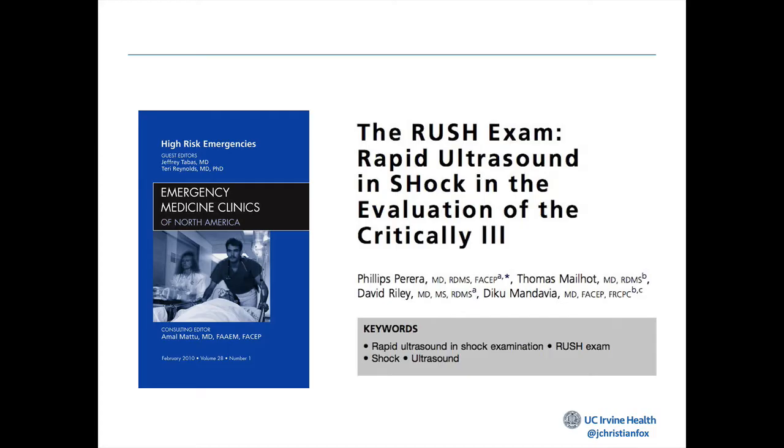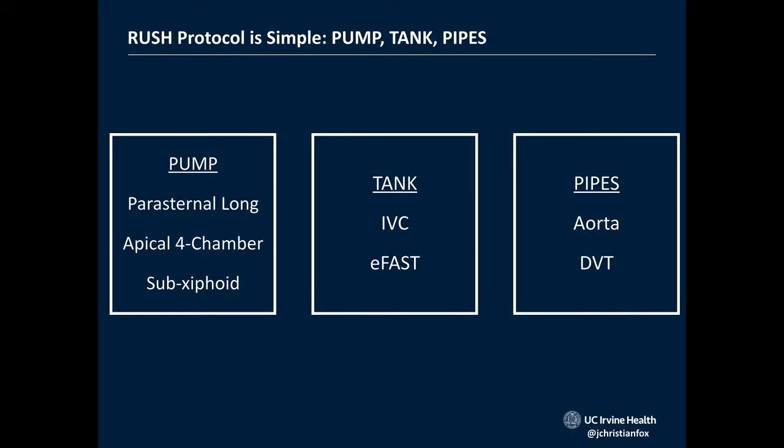You can find this article in the book Emergency Medicine Clinics of North America. It's kind of hard to track down. If you want the article, just email me and I can tell you how to get it. But basically, it's using ultrasound in these 3 ways.